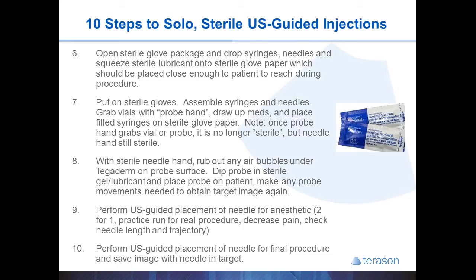You can save the image quickly and easily by hitting the freeze button once you've pulled the needle out of the patient. You can then go back 5 or 10 seconds to the images prior to hitting the freeze button and save any image you like, or save the whole video clip if you want.